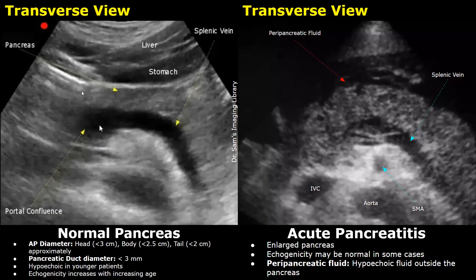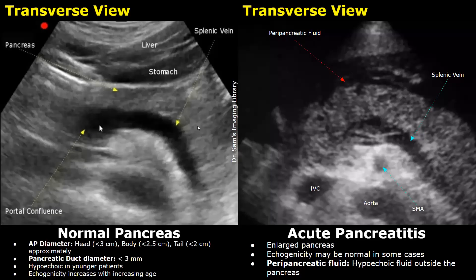In the image, the head is seen on the left side, which is the right side of the patient. The normal AP diameter of the head is less than three centimeters approximately. The body is in the middle, normally less than 2.5 centimeters in diameter. The tail is seen on the right side in the image, which is the left side of the patient, and usually measures less than two centimeters. The pancreatic duct, which is sometimes visible, usually measures less than three millimeters in diameter.